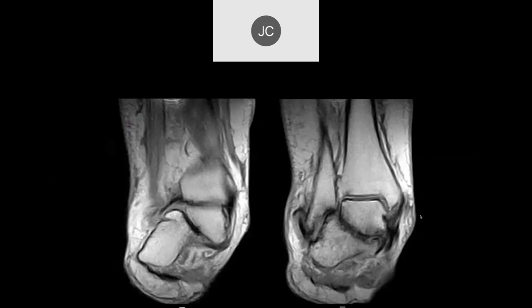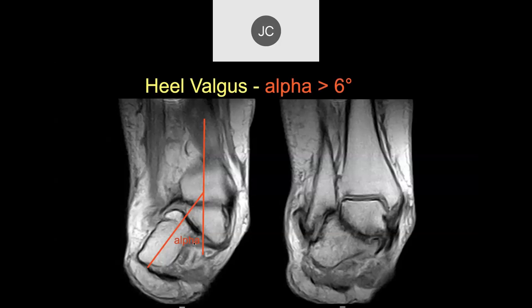Here it looks like there's some hind foot valgus. If we draw an angle between the long axis of the tibia and the axis of the calcaneus, this is called the alpha angle — like every other angle in radiology. If you have greater than 6 degrees, that's heel valgus. You can see here where it stops by impacting against the lateral malleolus, which is lateral bony impingement of the ankle, as we'll discuss later when we talk about impingement syndrome.